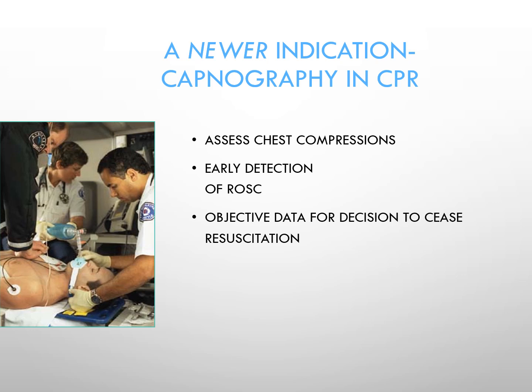The other end of the spectrum is when the end-tidal CO2 is very high, and it's very high for a very long period of time. It may also be an indicator that, not so much on the circulatory side of things, but on the ventilatory side of things, the patient has not been ventilated well for a long enough period of time that can cause irreversible damage.